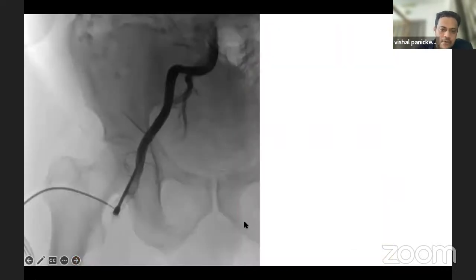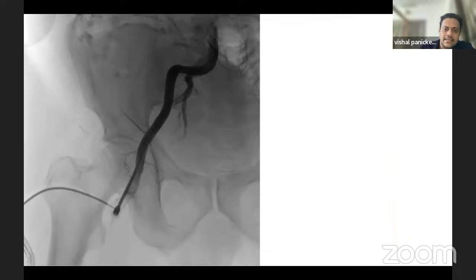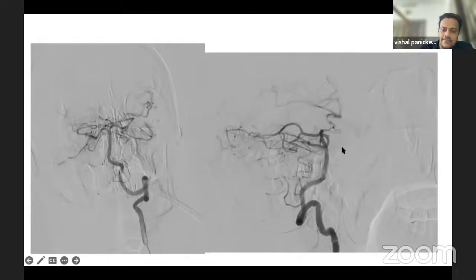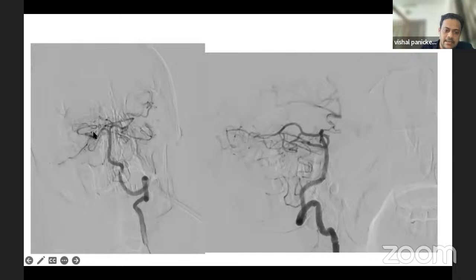We took him for mechanical thrombectomy through the right femoral route. With the coaxial technique, we took a diagnostic catheter — Picard and Cerebase. While trying to cannulate the left carotid, it would go into the left subclavian. So we took a left subclavian shoot, and here we can see the left vertebral artery and the basilar artery, and the PCA can be seen very nicely.